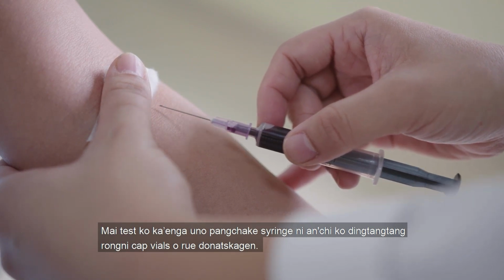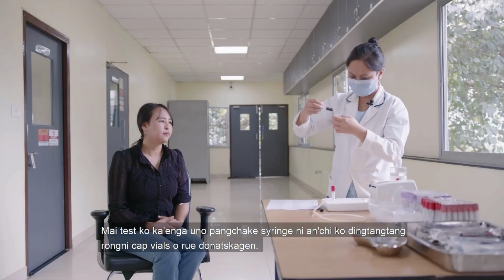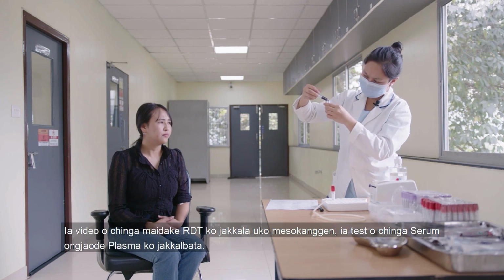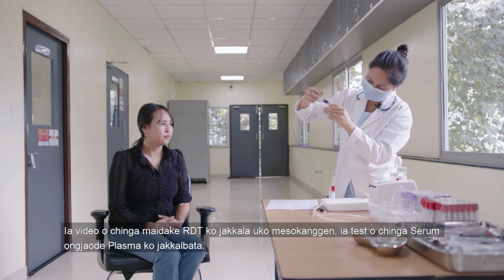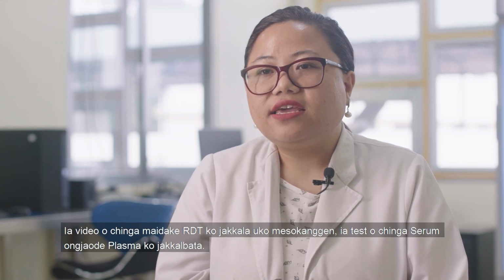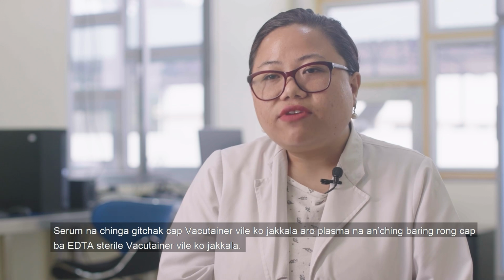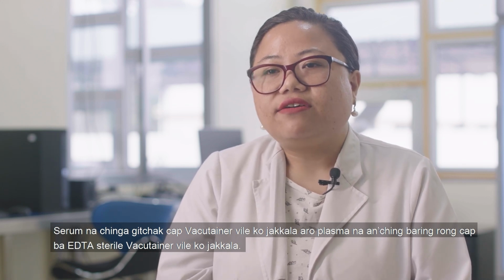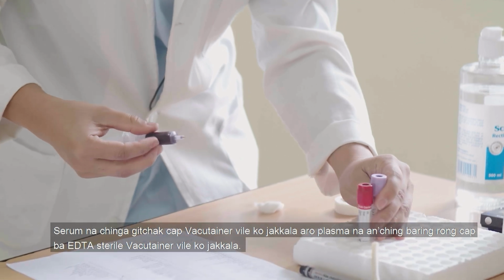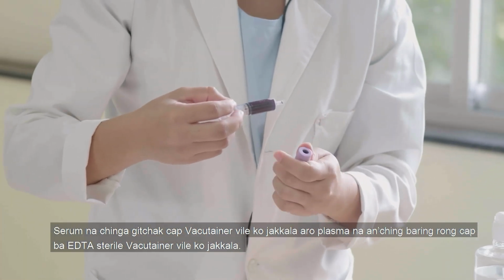Transfer the blood from the syringe to the required colored cap vials depending on what test is being done. In this video, since we are going to be showing tutorial for how to use RDTs, here we mostly use either serum or plasma. For serum, you use a red capped Vacutainer sterile vial, and for plasma, you can use a purple capped or an EDTA sterile Vacutainer vials.